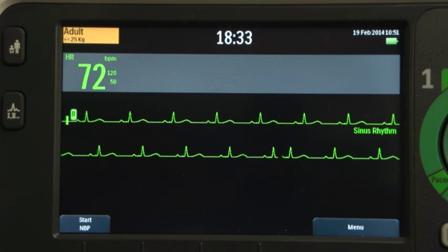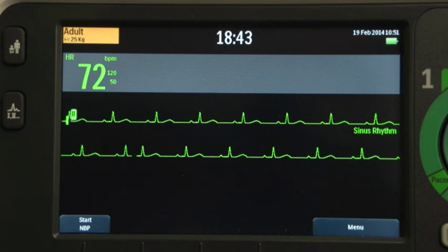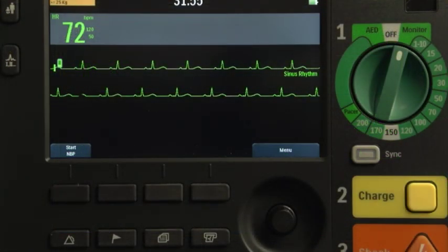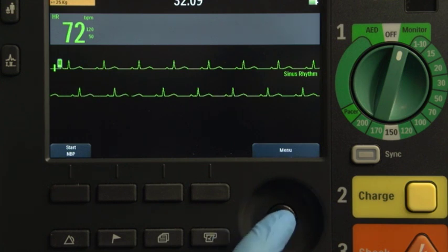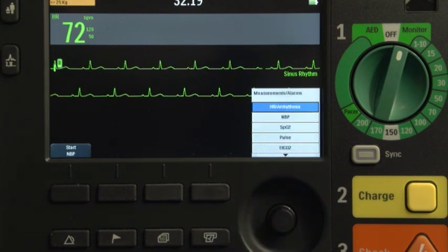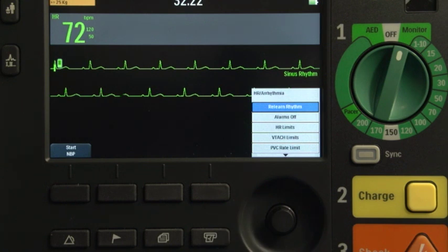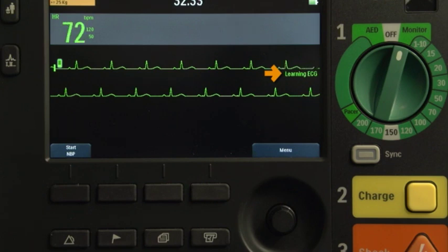The DFM100 uses the STAR Arrhythmia algorithm for monitoring arrhythmia. Arrhythmia analysis provides information on your patient's condition, including heart rate and arrhythmia alarms. It uses the ECG lead appearing in WaveSector 1 for single lead arrhythmia analysis. If the device is not identifying the patient's rhythm correctly, you need to initiate relearning. To do this, press the Smart Select knob, navigate to measurements alarms, select HR Arrhythmia, select ReLearn Rhythm, and press the Smart Select knob. The DFM100 will then display a message confirming that manual relearning has begun.